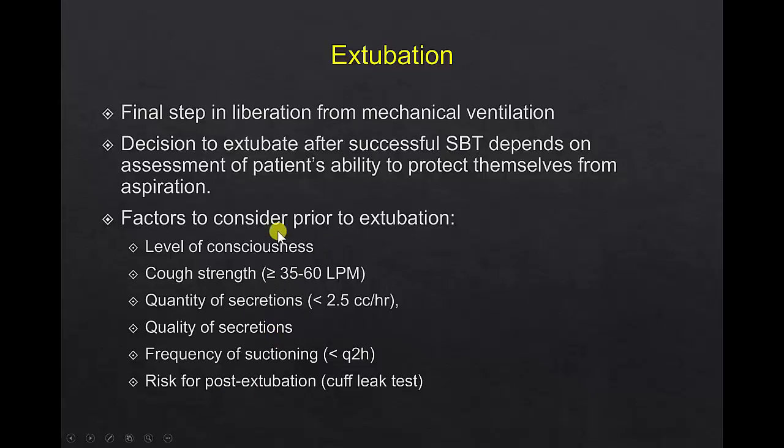Once we make a judgment call about all of this, we should extubate patients and not leave the tube in any longer than necessary. And our final thoughts on extubation is it's better to extubate someone that's marginal, that doesn't need the ventilator, and have to reintubate them than to not extubate them, because if you never give someone a trial of extubation, you'll have a higher tracheostomy rate in your ICU population.